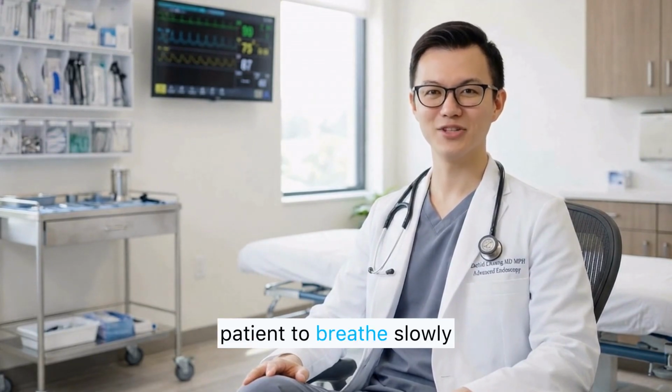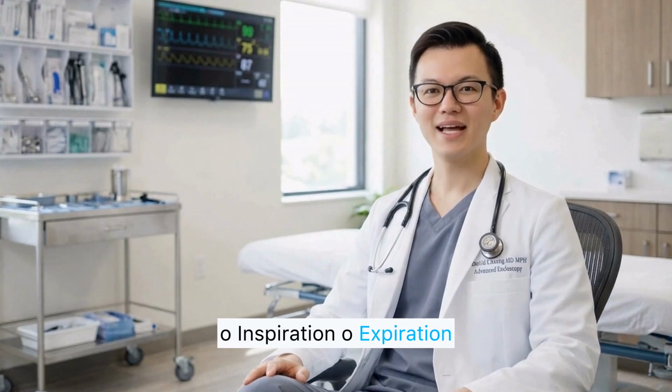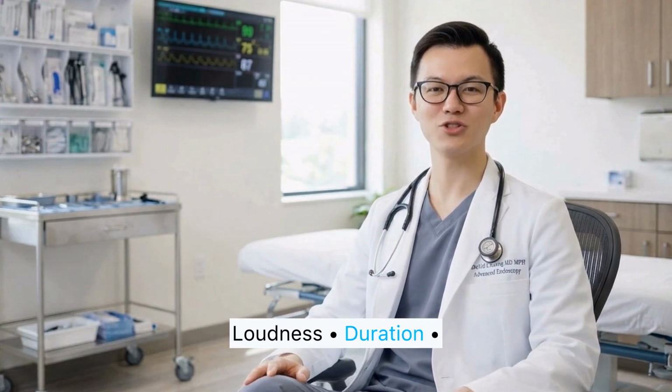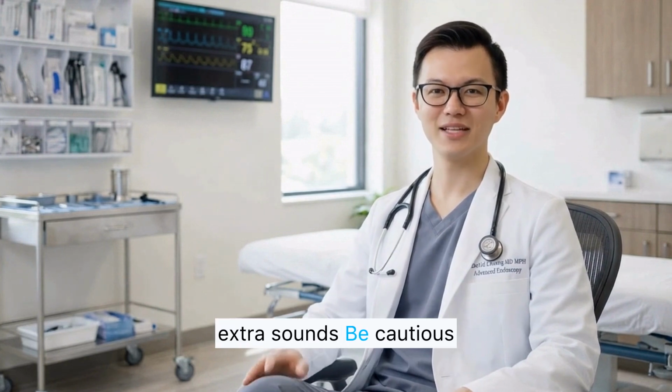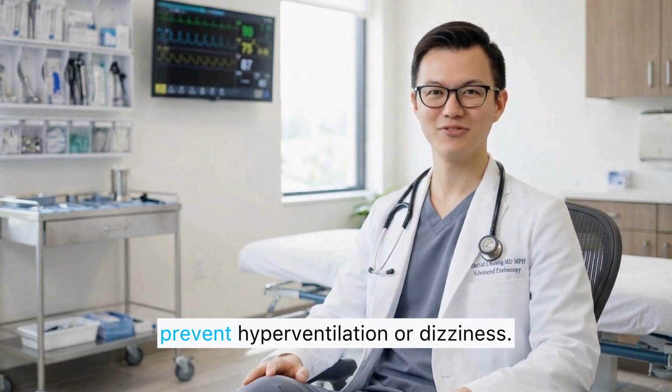Breathing instructions for the patient. Ask the patient to breathe slowly and deeply through their mouth. Listen to a full cycle of inspiration and expiration. Observe pitch, loudness, duration, symmetry, presence of extra sounds. Be cautious with patients who have respiratory distress. Allow breaks to prevent hyperventilation or dizziness.